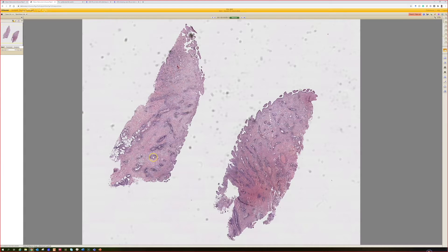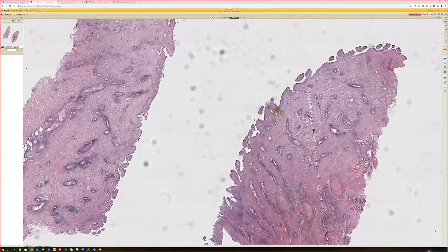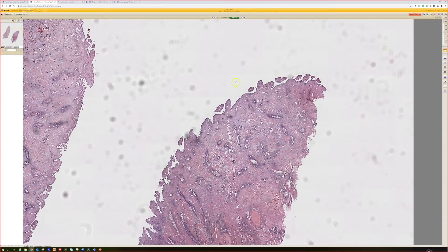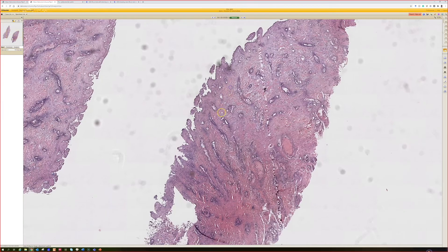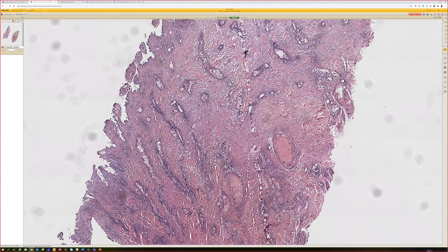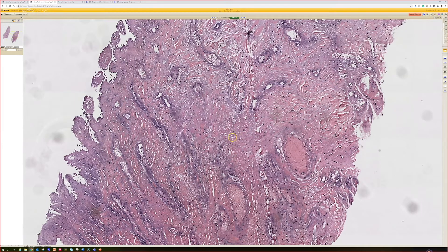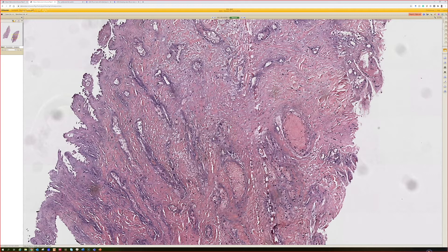It looks like a very sick tissue. I think the epidermis came off — yeah, totally detached. You can see the festooning, right? The little papillary dermis is there but the epidermis is gone. And then the tissue here looks pretty devitalized, but then there are these vascular structures throughout.